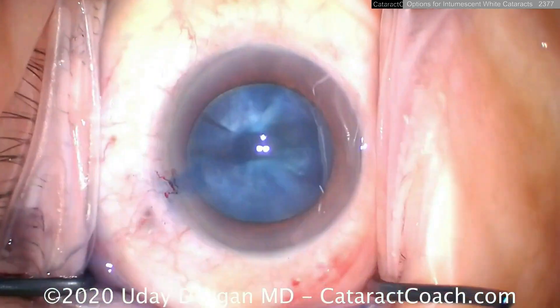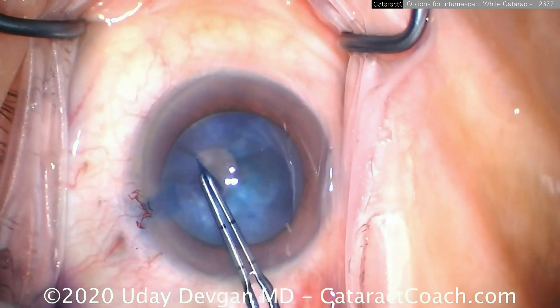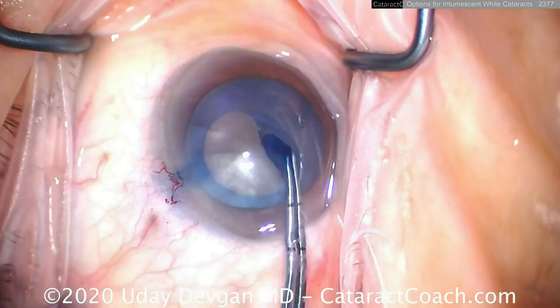So what happens if we don't decompress it? Well, in a case like this we're somewhat pressurized — we can just get the rhexis done, but watch what happens as I do this rhexis: it wants to run out on me. Look at that.